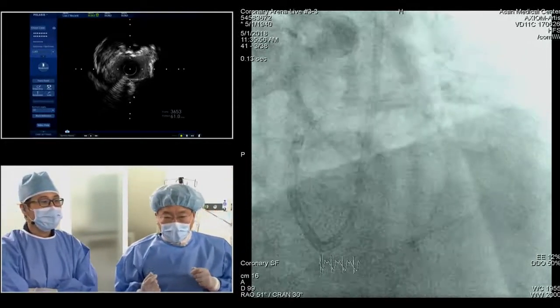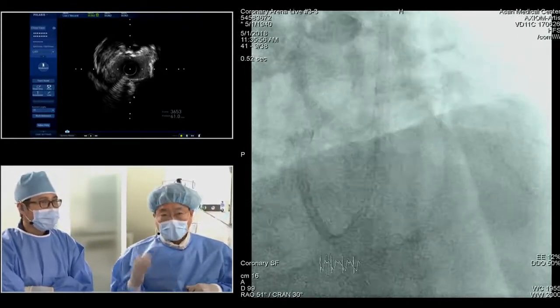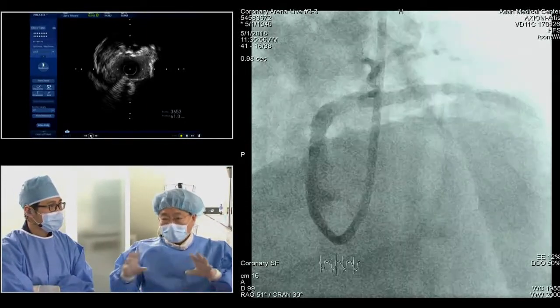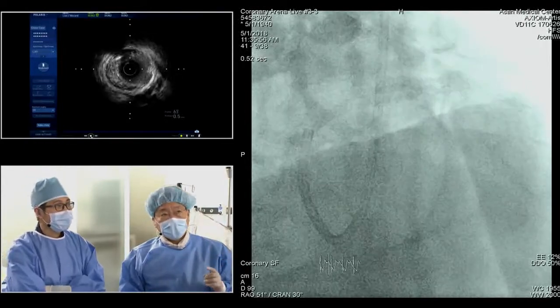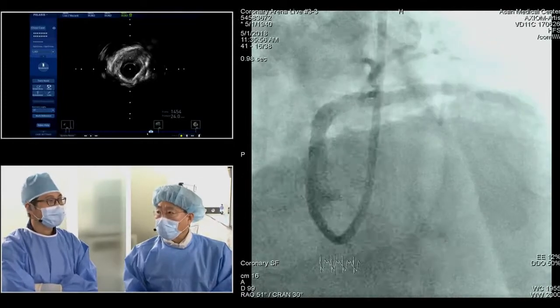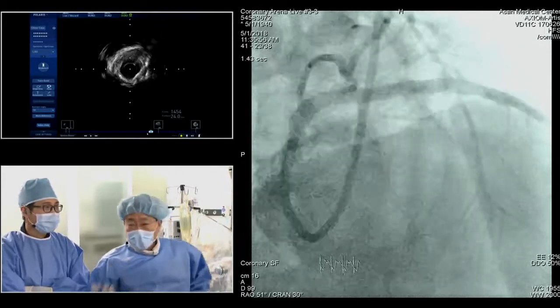To be honest, angiographically, sometimes we cannot pass the IVUS catheter itself, and so we do the rotablation first. However, we start with 1.5, sometimes 1.75 is the maximum. Because I don't believe too much in effective debulking, just the breakdown, pre-modification of the plaque itself. However, as you see by IVUS findings, there is encircling calcium, however, minimal lumen diameter is almost 3 millimeters, and so we cannot use it, the maximum burr diameter is 2 actually. So I don't expect too much. The reason is I use the non-compliant balloon first and more easy procedures.